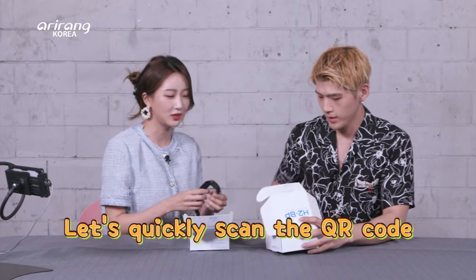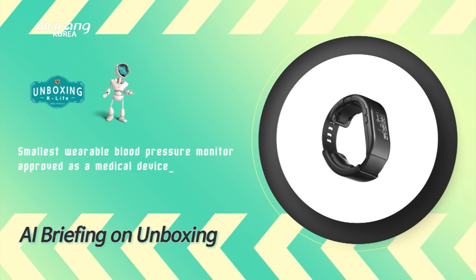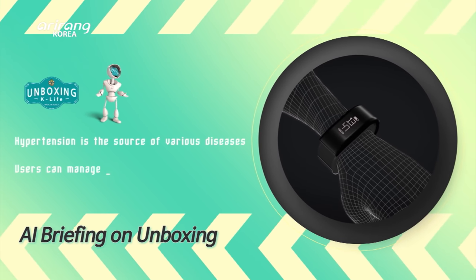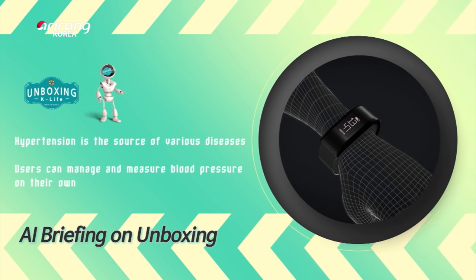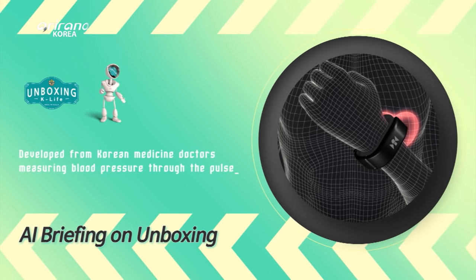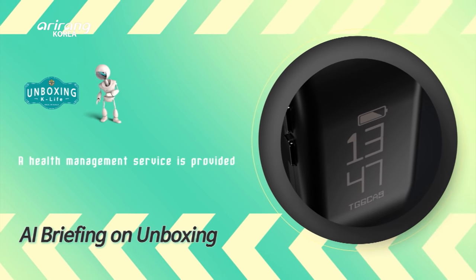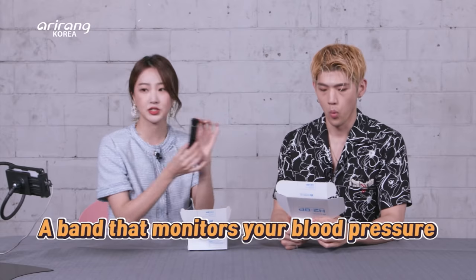Let's quickly scan it. It is the world's smallest wearable blood pressure monitor that's approved as a medical device. This product has been developed to monitor hypertension, which is the source of various diseases. This wearable helps users measure and manage their blood pressure on their own. The wristband blood pressure monitor was developed from the notion of Korean medicine doctors detecting blood pressure through the pulse. It's a wearable — I knew it. This wearable is a band that monitors your blood pressure.